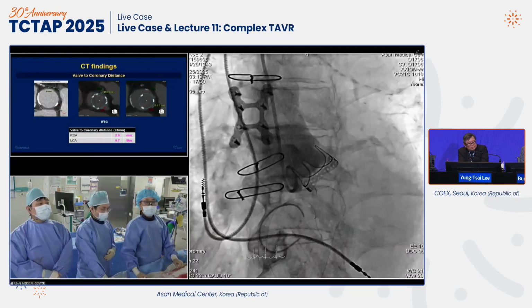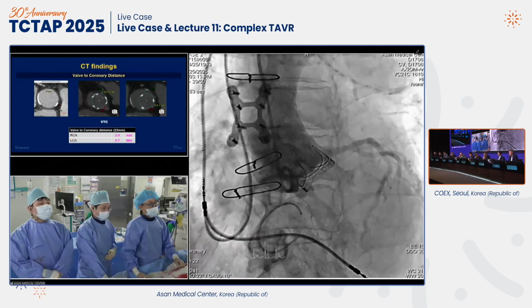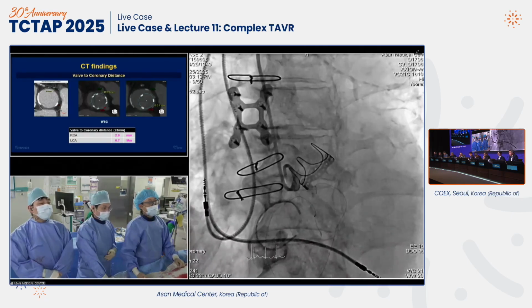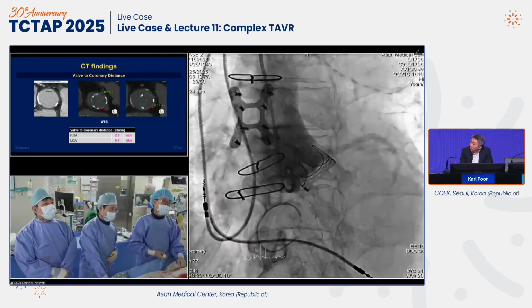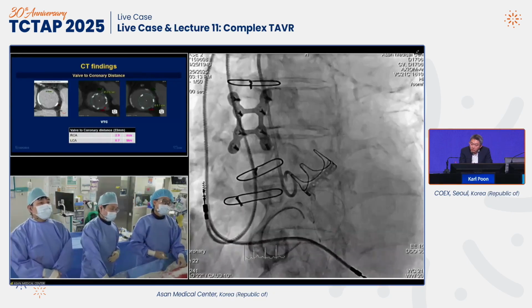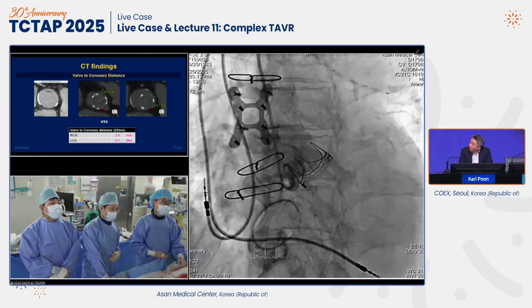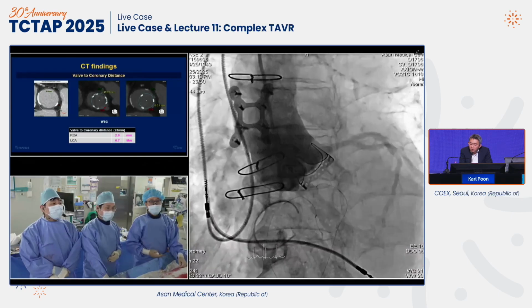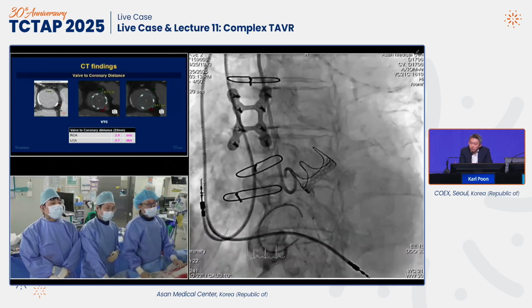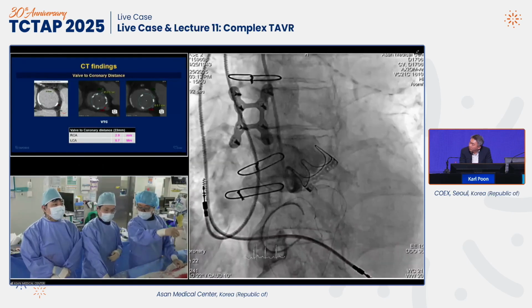The coronary obstruction mechanism here is twofold: the leaflet actually shutting down the left main, and sinus sequestration. So your point of puncture has to be spot on, unlike if it's just sinus sequestration. As to whether Unicorn's better, I can't comment on that. But I was going to ask David, in this case, if cost is not an issue, is Shortcut superior to BASILICA? Because I don't have that in Australia.